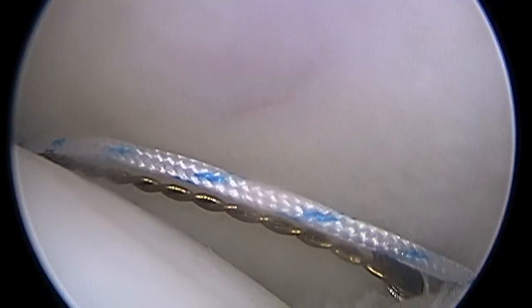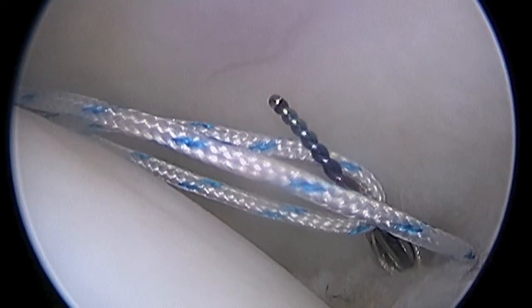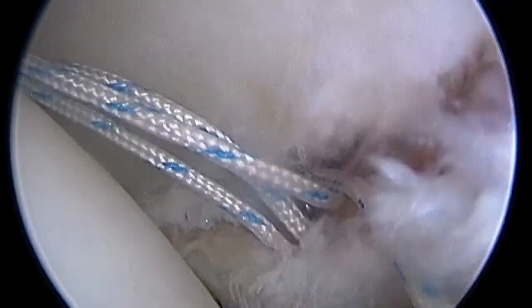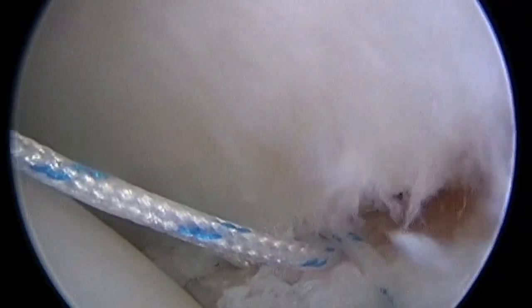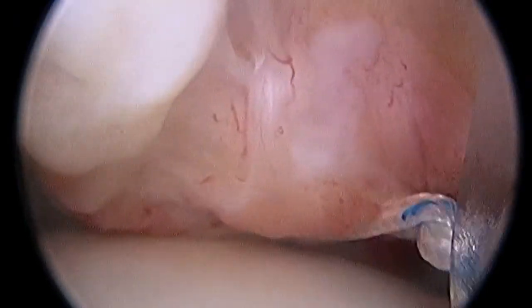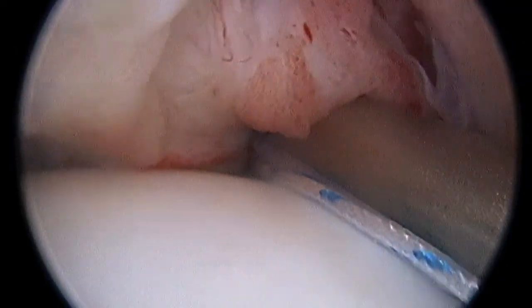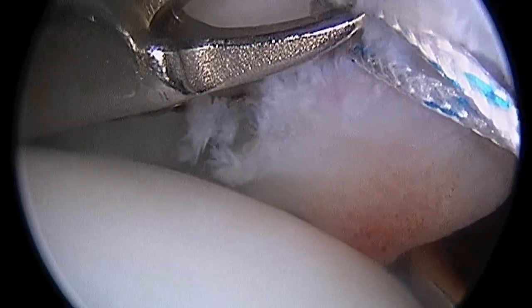We're going to place that in that specially designed suture passer, and then atraumatically pass it through the labrum and ligament as is seen there. We'll do the same thing with the second arm of the suture, and then when we tie that down, you'll see how the labrum and ligament reduces. There you see me sliding a knot in from outside the body to tighten up that tissue. Here's a special suture cutting device that we use to cut the stitches, and now the ligament and labrum is more where it should be on the glenoid rim.